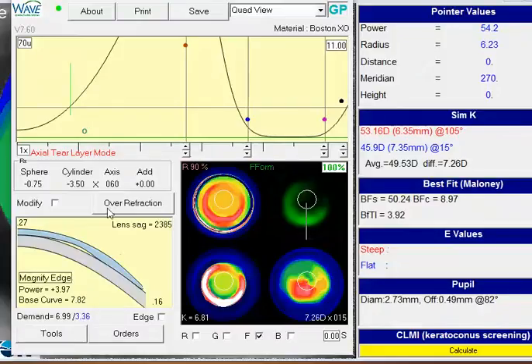A couple little general observations. If you recall, this unique refraction that you have is really a representation of this distorted cornea that you have from the keratoconus. And so it doesn't really represent the true optics of the eye. It's just based on this abnormal cornea. So if we look at the simulated K readings, you'll notice the axes are quite a bit different than your spectacle refraction.